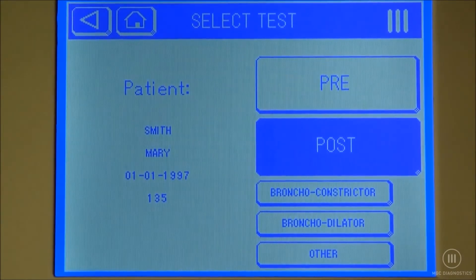In post mode, we can do a bronchoconstrictor or a bronchodilator. In our example, we're going to select bronchodilator.